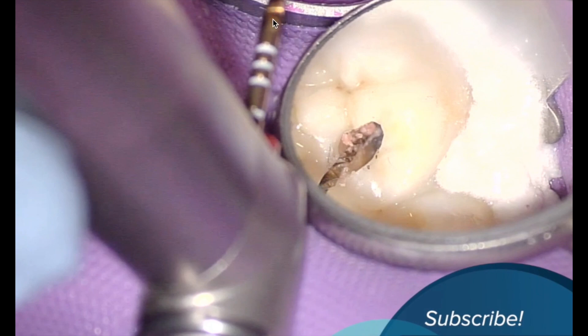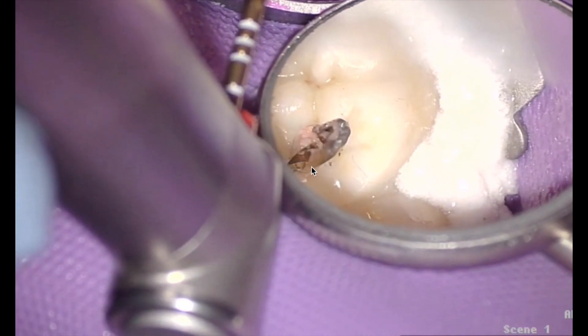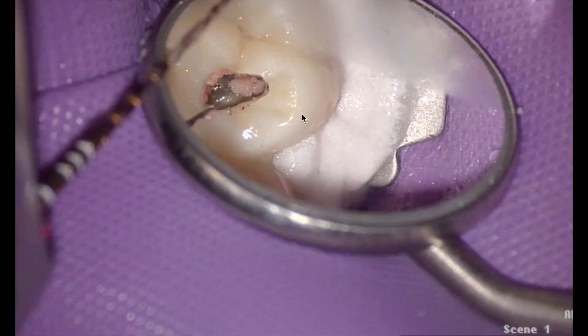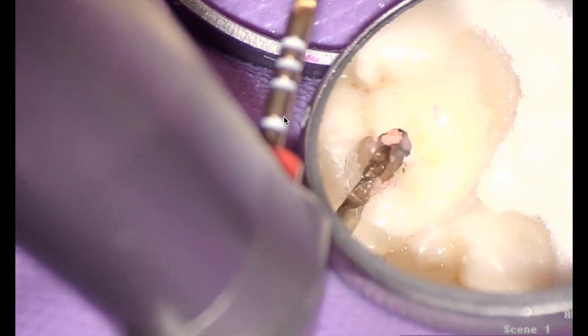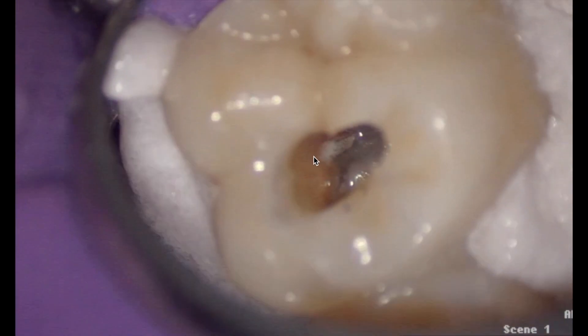So it's 16 millimeters. Most teeth are 19 to 21 millimeters long, so I'm three to five millimeters short of the working length. What we're doing is just getting space. In this distal buccal I didn't get a lot of space — it just kind of stopped moving apically, and that's fine. But what it does is it helps you triangulate what's going on. I'm just going to open this up again to show the depth of the cutting flutes on my palatal.